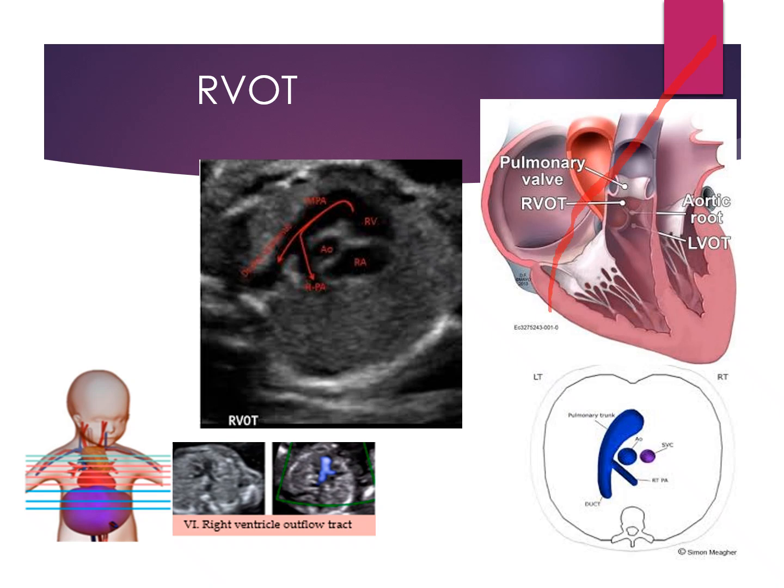That wasn't very straight, but we have a bit of the right ventricle in there, a bit of the right atrium, a bit of the aorta, and the pulmonary artery in its long axis. And that will allow us to see, as it comes up, our right pulmonary artery, and then our ductus going that way.